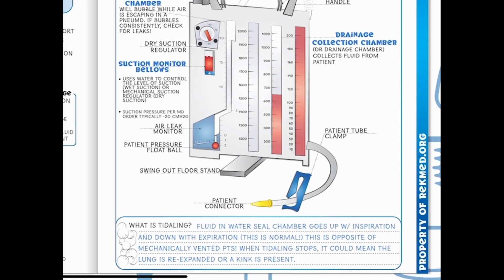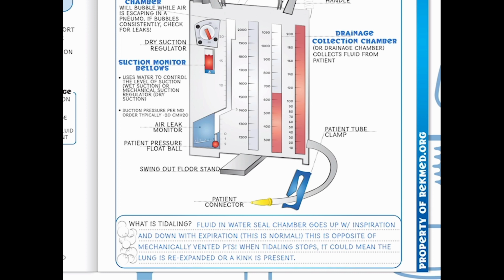And lastly, what is tidaling? So this is fluid in the water seal chamber that goes up with inspiration and down with expiration, and this is normal. So this is the opposite of mechanically ventilated patients. When our tidaling stops, this could mean the lung is re-expanded or a kink is present.